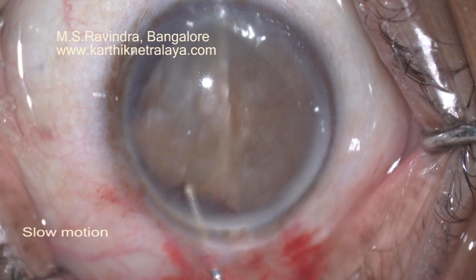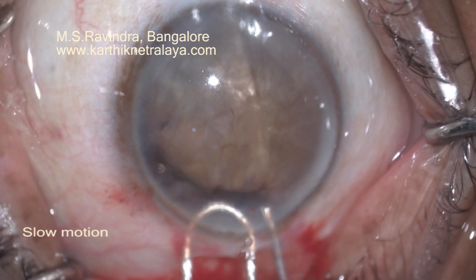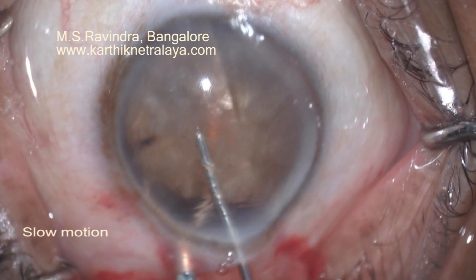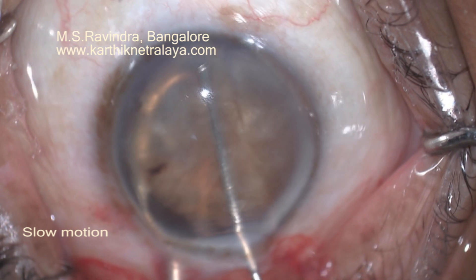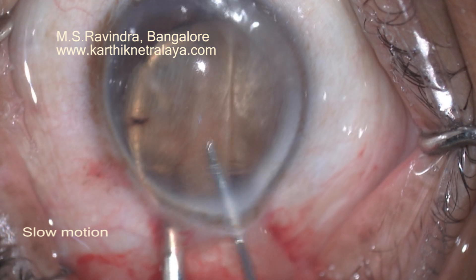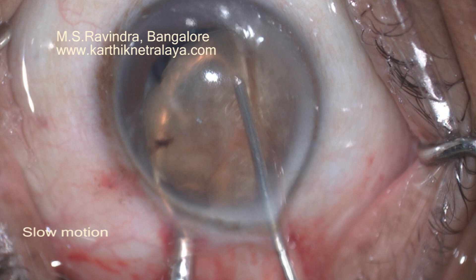Damage to the endothelium needs to be prevented. As the nucleus is taken out from the capsular bag, the traction and forces on the zonules is nil. Even if the zonules are compromised, it doesn't really matter because nothing is being done in the capsular bag. It's of paramount importance that you protect the endothelium by using continuous infusion of HPMC in front of the nucleus.